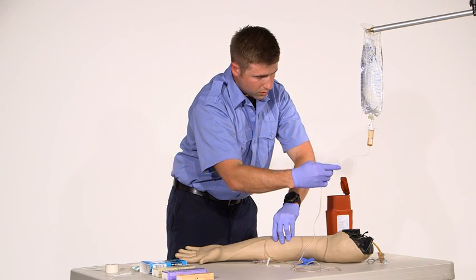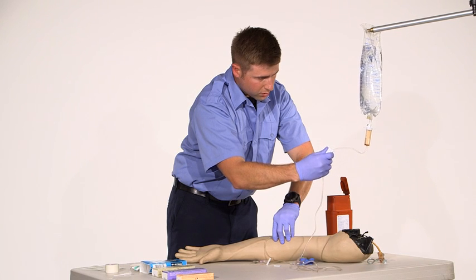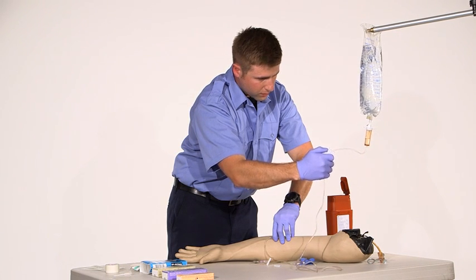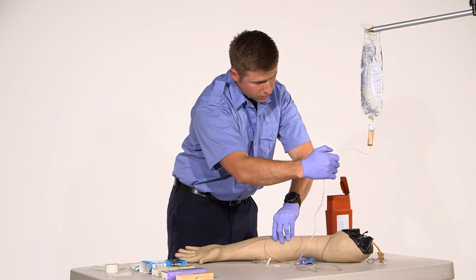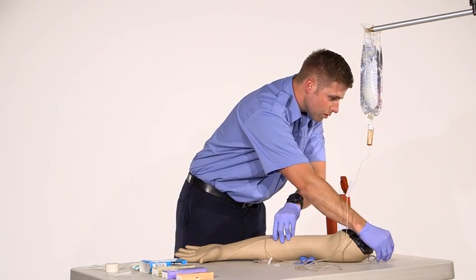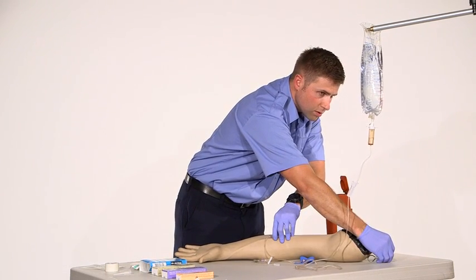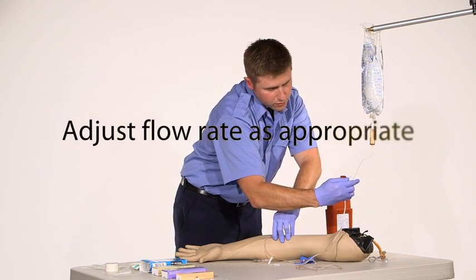Make sure that I'm going to float just for a moment. Make sure I get proper flow. And bring it down to a TKO.